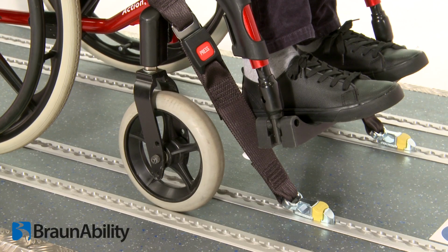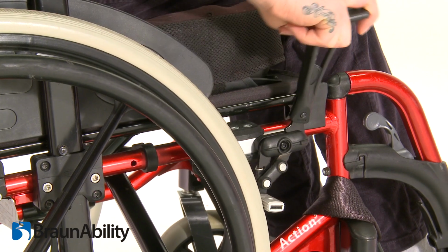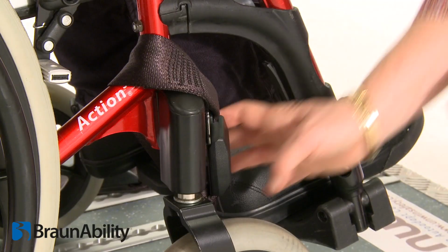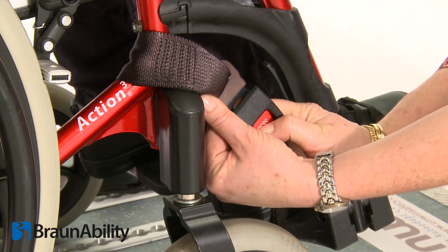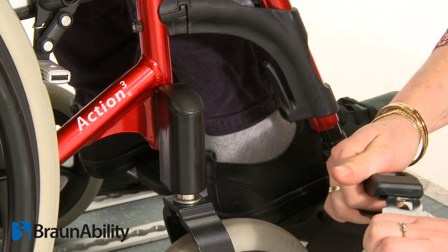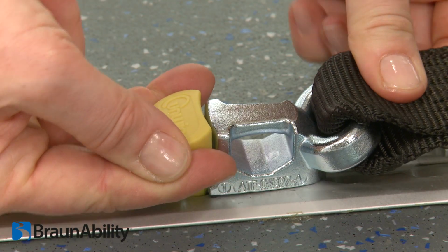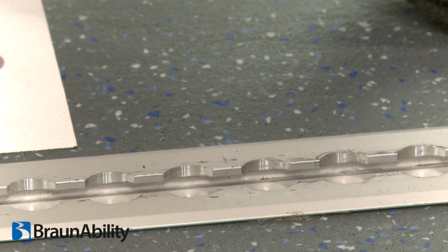Release the wheelchair brakes, push the wheelchair forward and reapply the brakes. Remove the front straps by depressing the buckle button and release the front tie-downs from the rail. Store Kit 2 in an appropriate place in the vehicle.